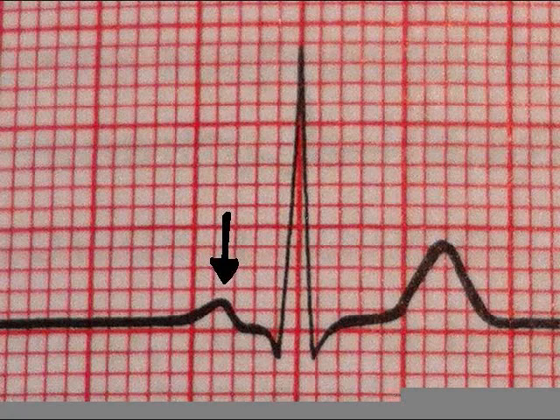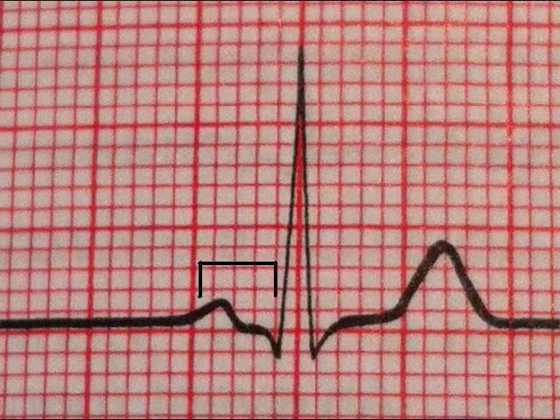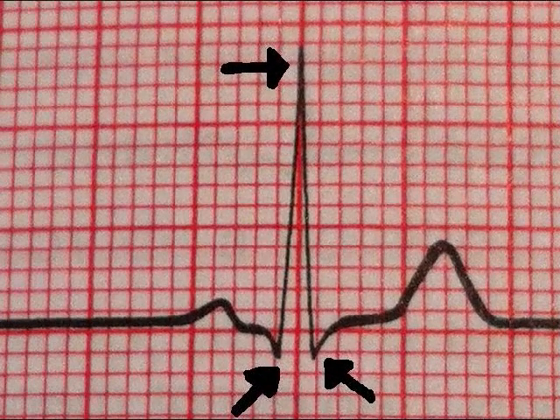The first wave is called the P wave. This represents atrial depolarization and contraction and lasts approximately 1/10 of a second. This is the PR interval, which represents the time from the start of atrial depolarization to the start of ventricular depolarization. It indicates the delay of conduction from the SA to the AV node and lasts approximately 0.12 to 0.2 seconds. The QRS complex represents ventricular depolarization and normally lasts less than 0.12 seconds.